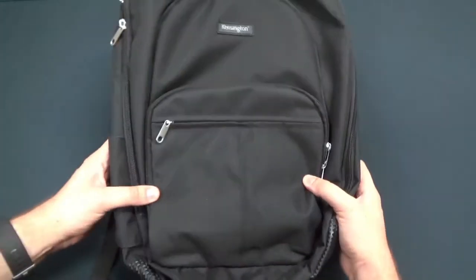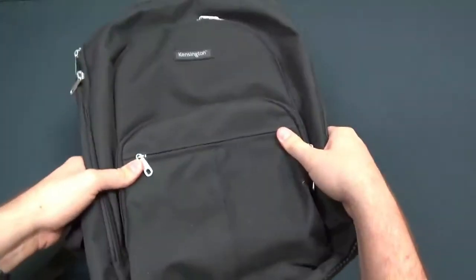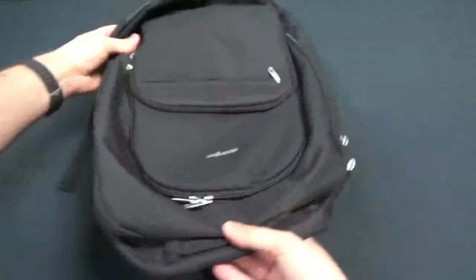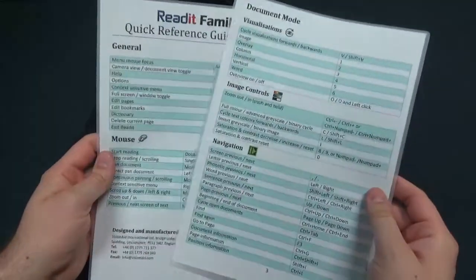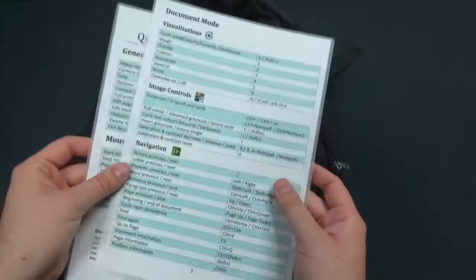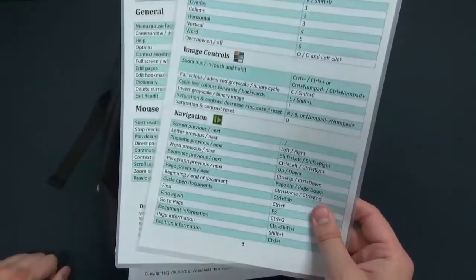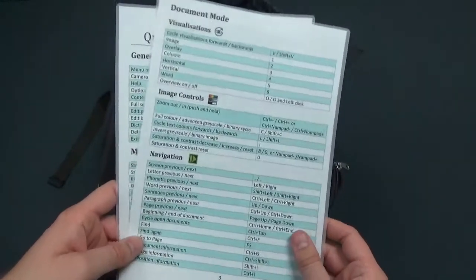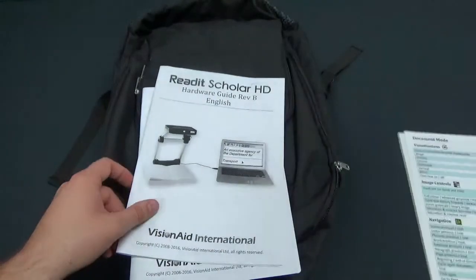Here we are up close with the Scholar HD inside of its backpack. It is a pretty nice backpack, and it does come with it for free, which is a nice feature. Let's go ahead and open it up and see what's inside the bag. First of all, you get some literature — two keyboard shortcut or hotkey quick reference guides. They're even laminated, so if you want to increase your proficiency with the ReadIt software, here's a list of keyboard shortcuts to help you do that. It's a little faster than using the control panel, which I'll show you in a minute.